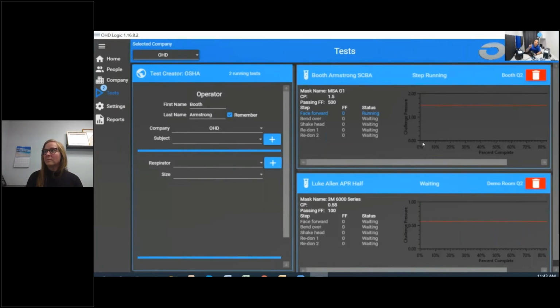When it reaches that red line, the QuantaFit 2 is going to know that it's pressurized the mask to the degree that it wants. What it's going to do is trace that red line. It's going to hold that pressure, and it's going to ask one pivotal question. How much air is penetrating or breaching the seal of the mask? That's how we're going to determine the fit and integrity of the respirator, whether it's good or not good. So let's jump in, show you that in action.